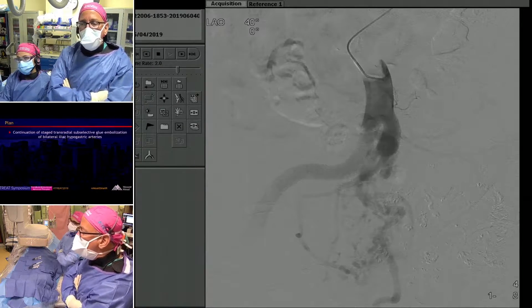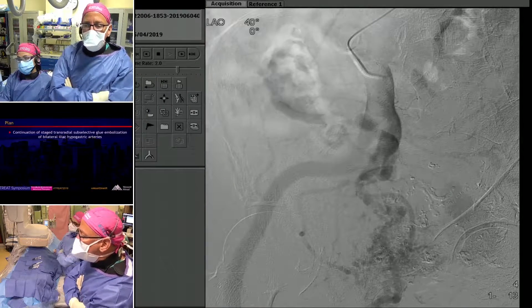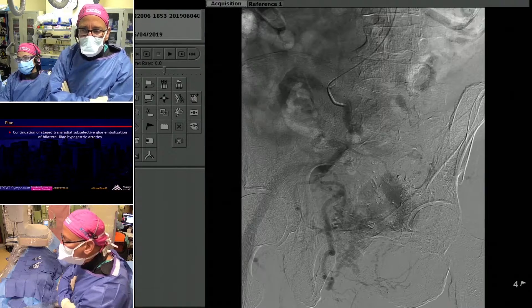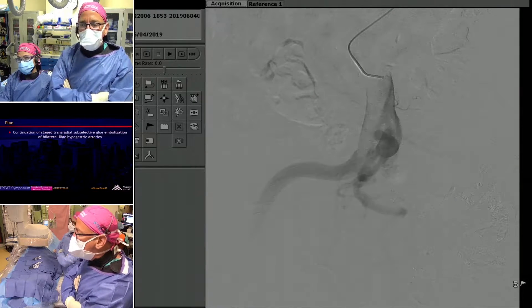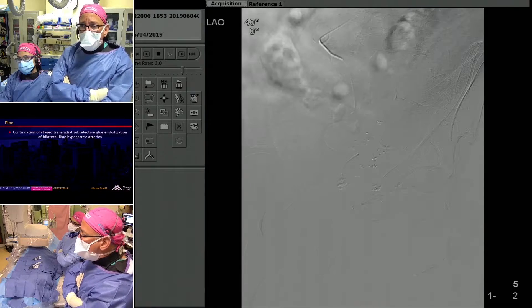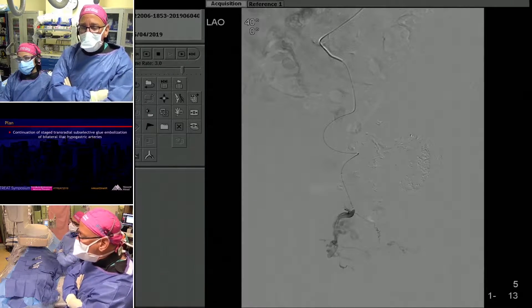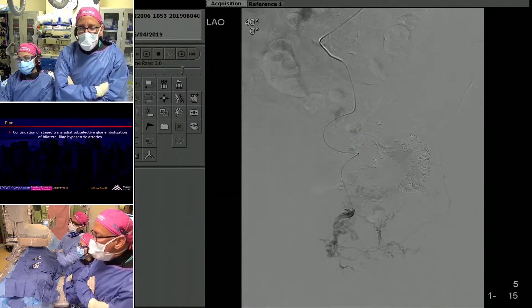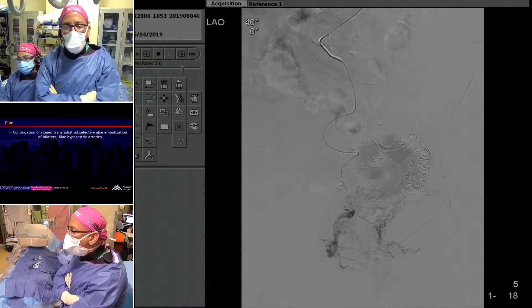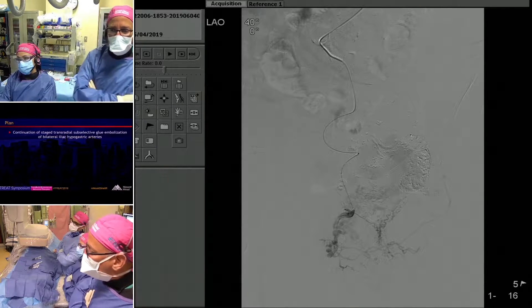Here's just a magnified-up view. You can see there are a number of hypertrophied vessels. There's one coming down the midline — we felt that was likely the obturator. We finally got into that, and again we felt this was the obturator. We're seeing a lot of what I'd call normal arterial branches feeding the pelvis. At this point our 155 microcatheter was actually hubbed.